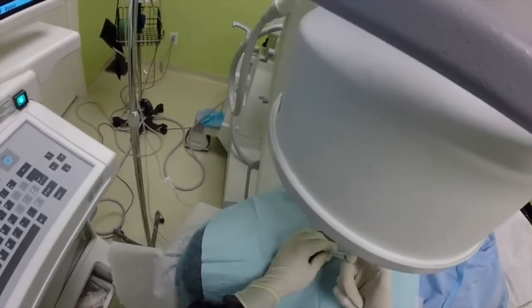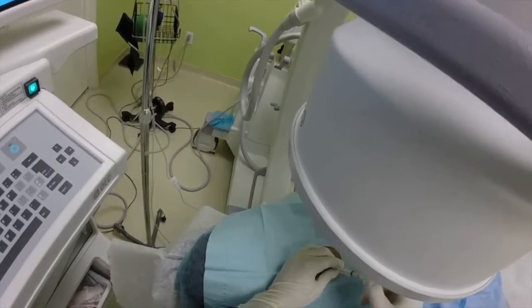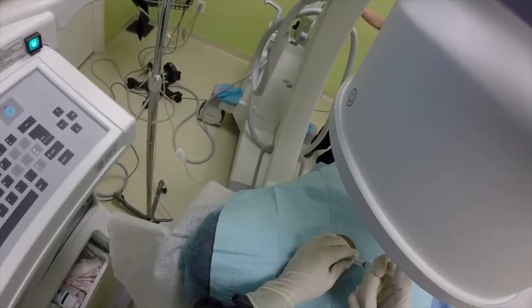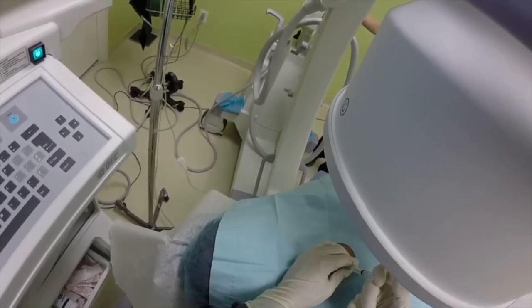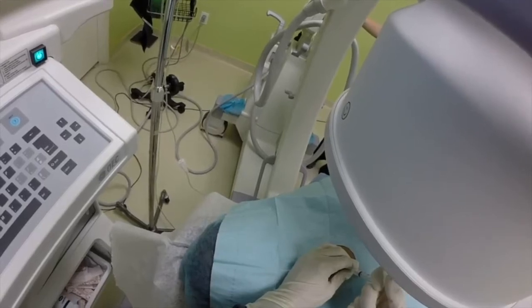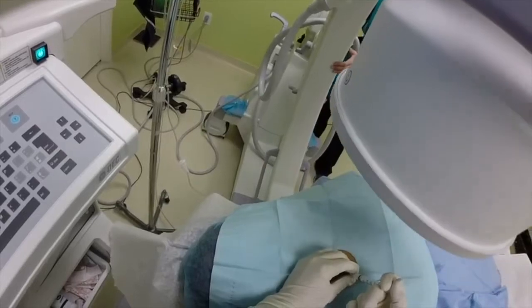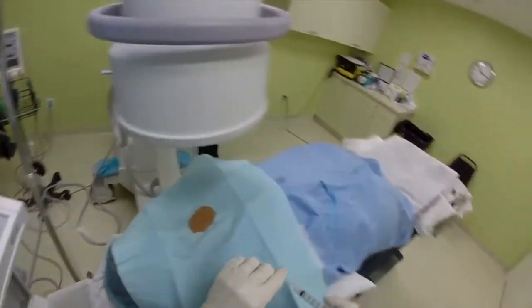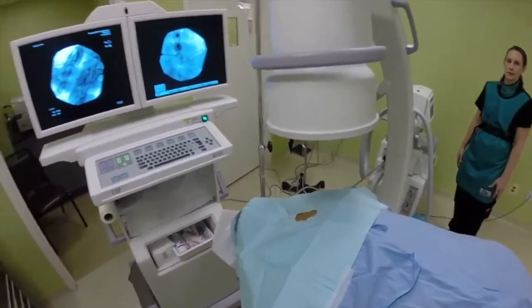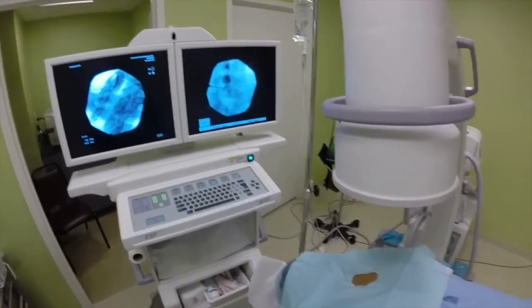Now it's safe to inject medication. I'm injecting slowly a mix of Kenalog and normal saline. We're all done, my needle is out. This is the end of this demonstration. If you want to know more about contrast spray technique, you can read my articles in Pain Medicine. Thank you.